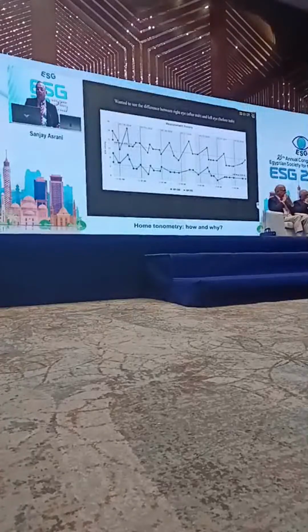So now, wanted to see the difference, right eye after trabeculectomy and left eye before trabeculectomy. So this is the right eye, and that's the left eye. So he had trabeculectomy in both eyes and has been stable since.